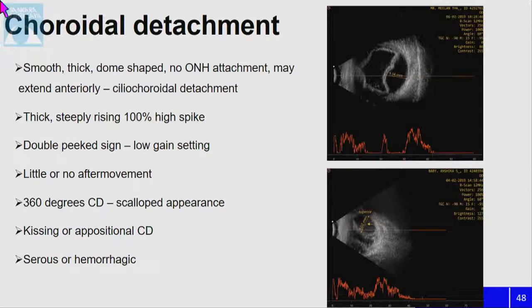Preoperative assessment in a tractional RD is important, as in where to make the sclerotomies, the PVD status, as well as the presence of vitreous schisis, all that is important.